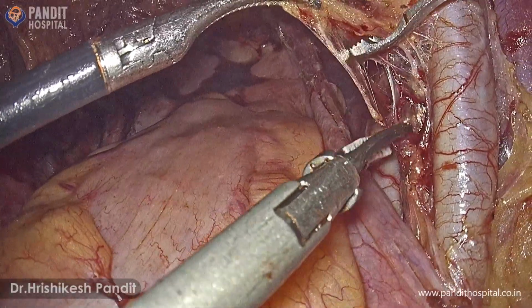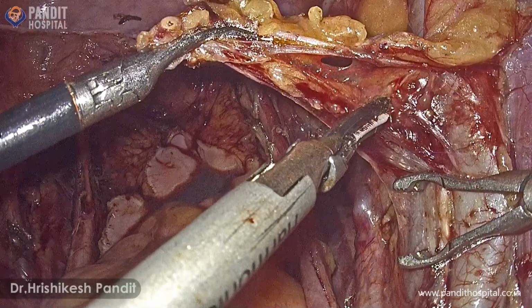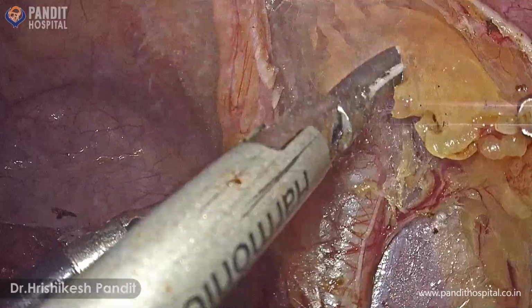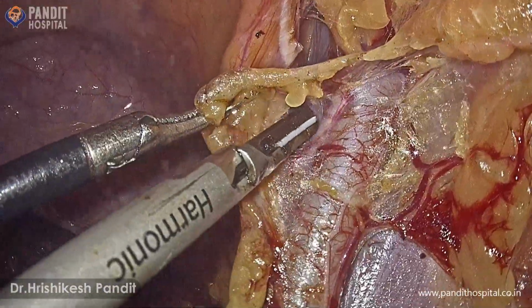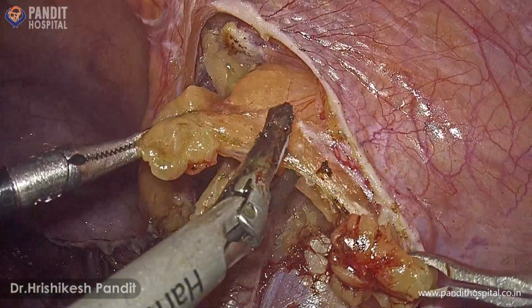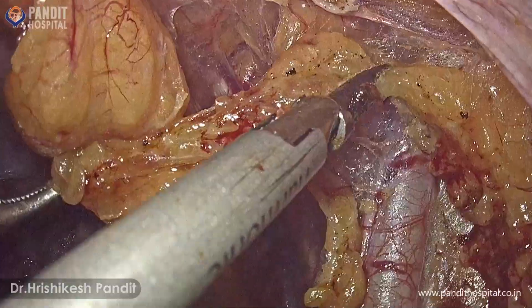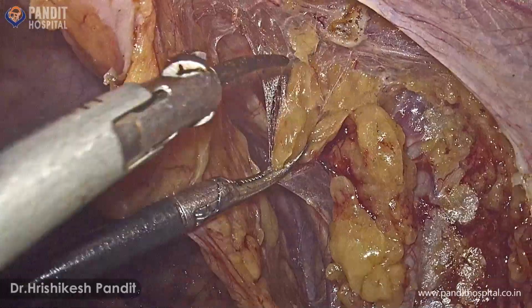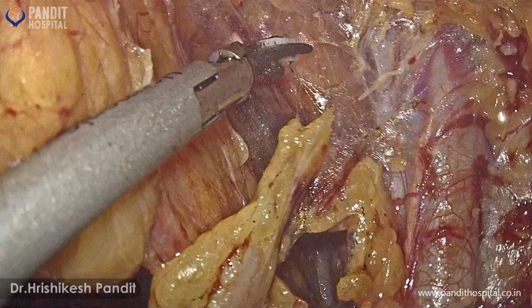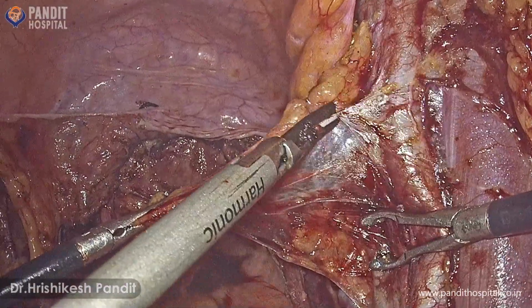The anterior limit of dissection is the deep circumflex iliac vessels. The entire lymphatic tissue is to be dissected and removed en bloc. Care is to be taken to prevent any capillary bleed which will spoil the entire surgical field. While dissecting the obturator group of lymph nodes, care is to be taken to prevent injury to the obturator nerve and vessels lying in the obturator fossa.